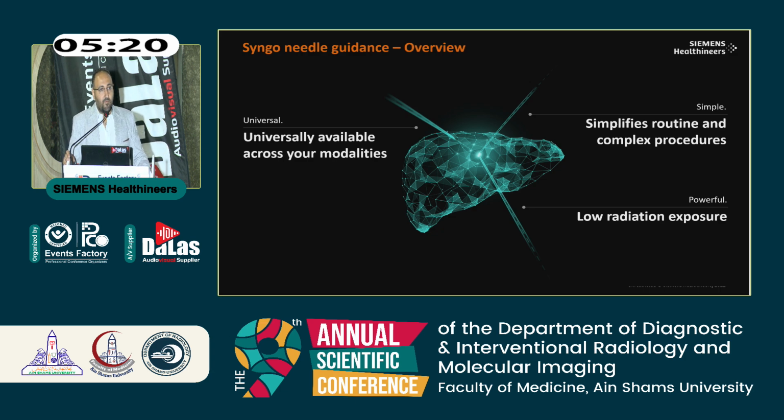The benefit for the physician is that the procedure will be more accurate and easier. The benefit for the patient is that because it's live imaging, we are advancing our needle under live fluoroscopy, so every time I advance the needle, I can see the tip of my needle. And there is less dose exposure, because it's fluoroscopy guidance, not CT guidance.